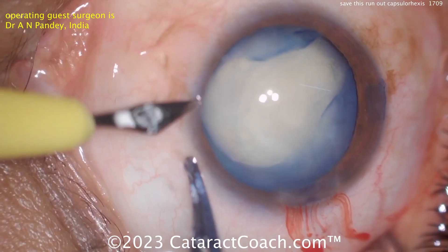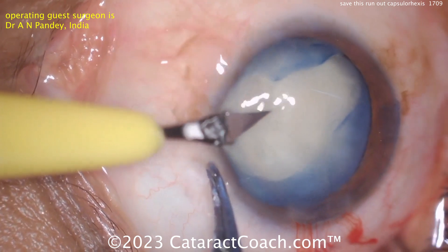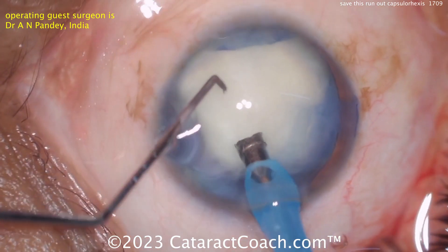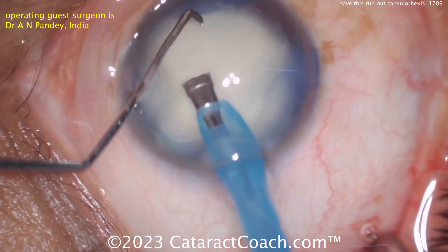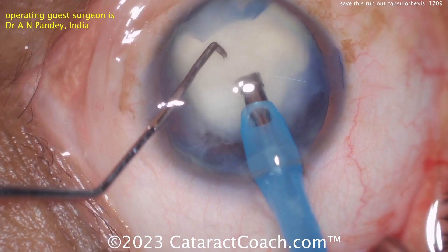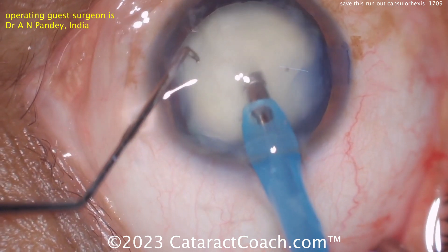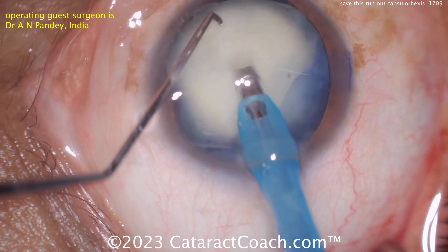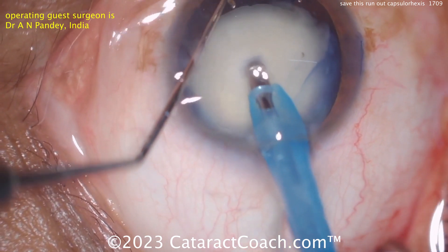Continue the rexis this way so you have that one irregular area. It did radialize out there and you could be in some trouble — don't let that rip around to the posterior capsule. Phaco probe going inside here; interesting positioning of the infusion holes on the irrigating sleeve makes me nervous.